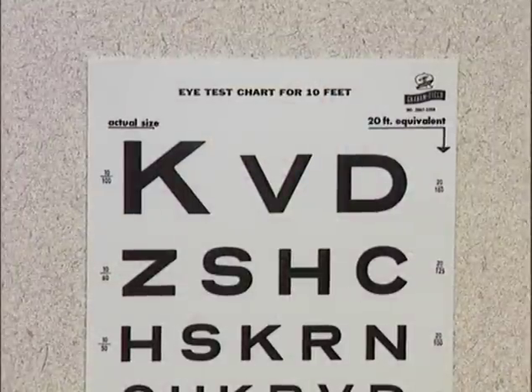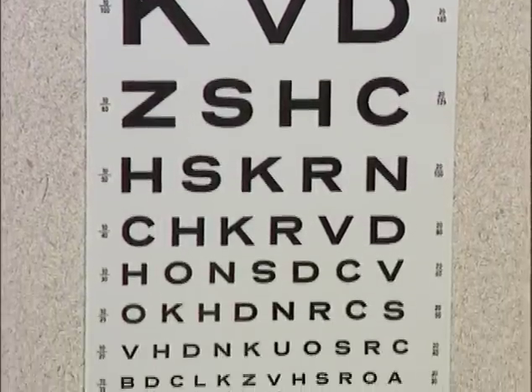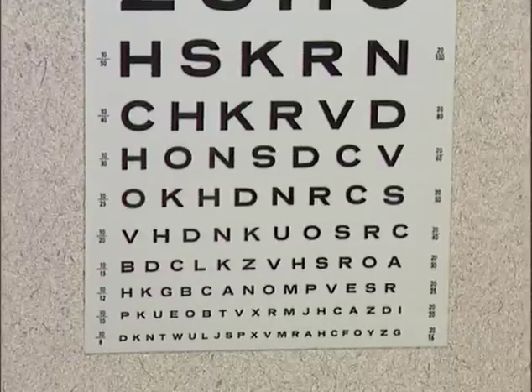The familiar Snellen distance visual acuity chart displays lines of block letters of diminishing size, each defined according to the distance at which the lines of letters can be read by a person with normal acuity. For example, the top number represents the distance in feet at which the test was performed, and the bottom number corresponds to the distance at which the letters could be seen by a person with normal visual acuity.